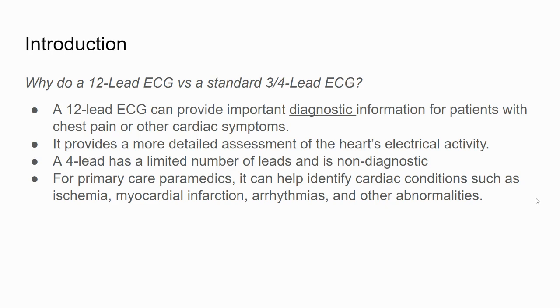So a 12-lead ECG can provide a lot more important diagnostic information with patients with chest pain or other cardiac symptoms. That's important to note. It's diagnostic, meaning you can actually look at a 12-lead ECG tracing and provide a diagnosis, versus a 4-lead, which has a limited number of leads. So we have a limited number of views of the heart. Because of these limitations, it is non-diagnostic.